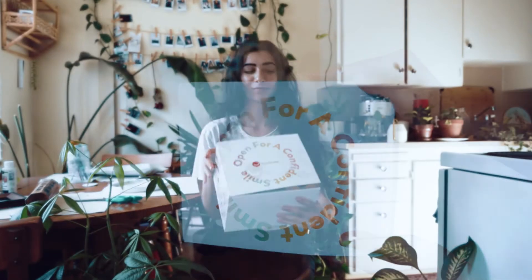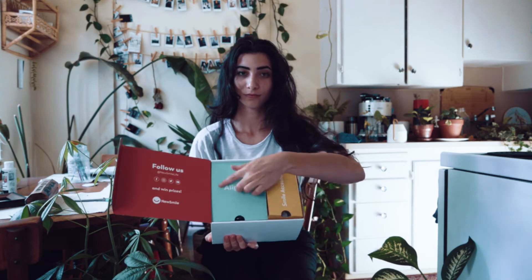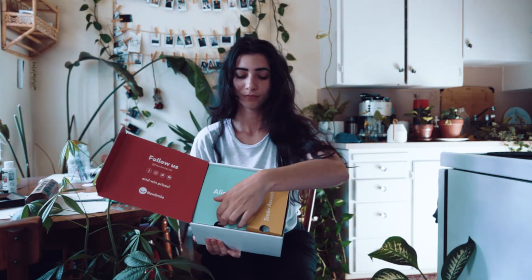My new smile aligners finally came in the mail. This is what the box looks like inside — you have your aligners and then your smile accessories.